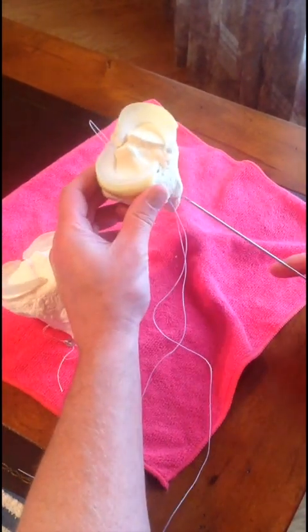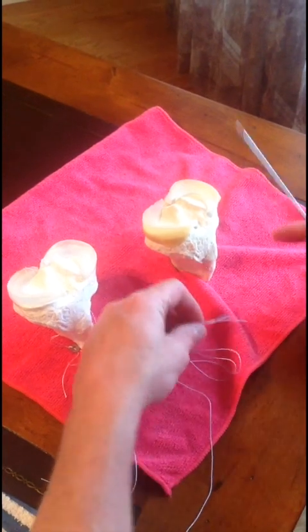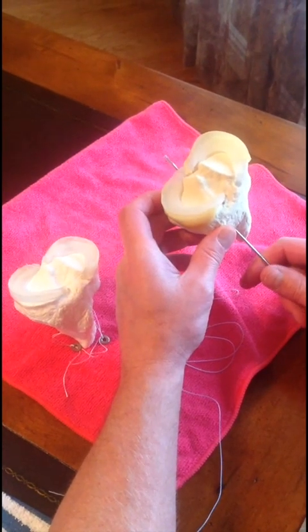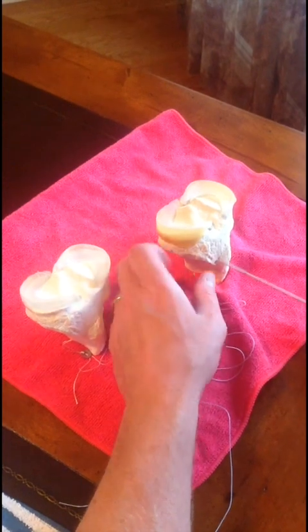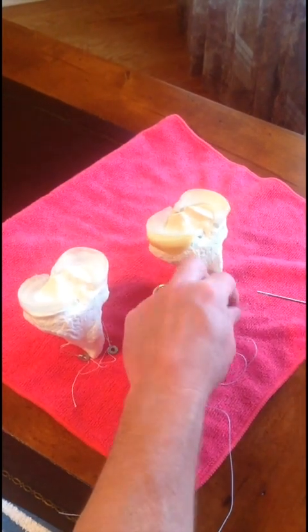I like to actually decorticate the bone with a high speed burr, and then I'll drill for a medial route from the medial side just medial to the tibial tubercle, and from the lateral side just lateral to the tibial tubercle. I find that I can easily reach the anatomic insertion of the root and get a good root repair without having to worry about crossing my tunnels or running into any type of graft construct.